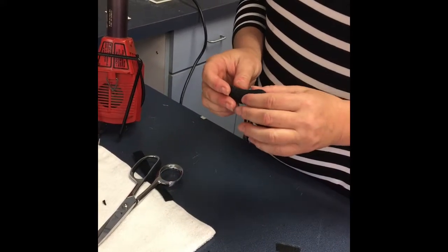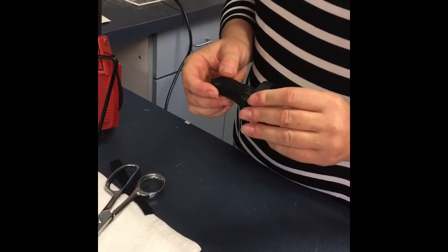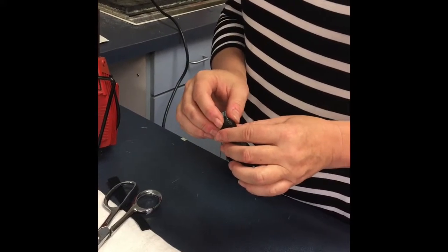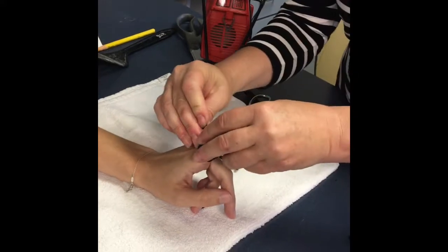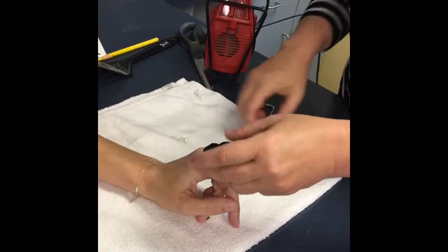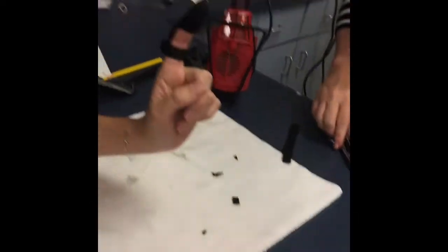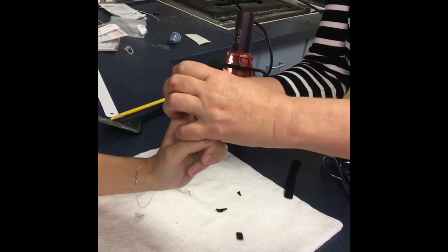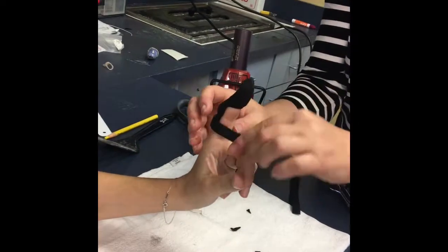This is typically worn for the first three to four weeks of the mallet finger protocol. The strap is removed multiple times throughout the day to allow for PIP flexion. In between exercise sessions, the strap may be reapplied. For exercise, the velcro strap may be removed and protected flexion may be achieved.